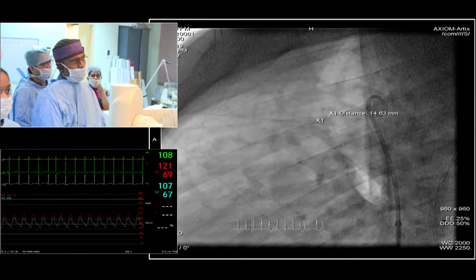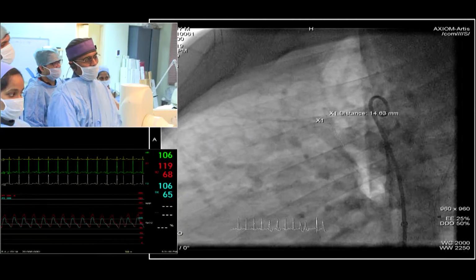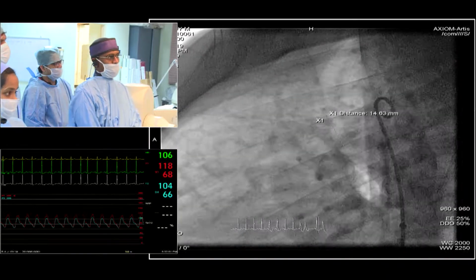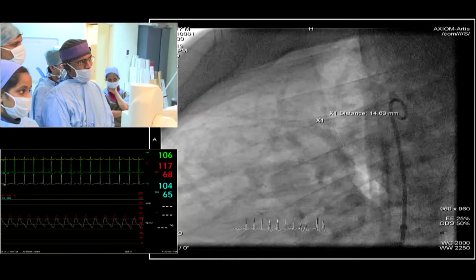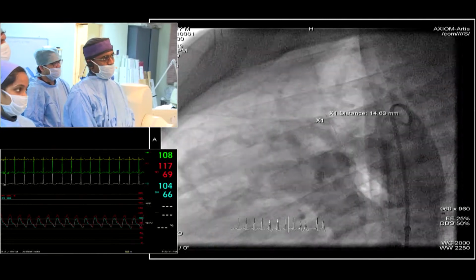Okay, now the question that I wanted to ask: whenever the ductus is extremely large, what is the utility of an aortogram? Right now in this particular patient, we are giving 25 mLs at 15 ml per second at 1,000 psi pressures, and this is the picture that we get. Sort of faint images. We froze the frame and we recorded. It's coming to about 15 millimeters. So it's very faintly filling.